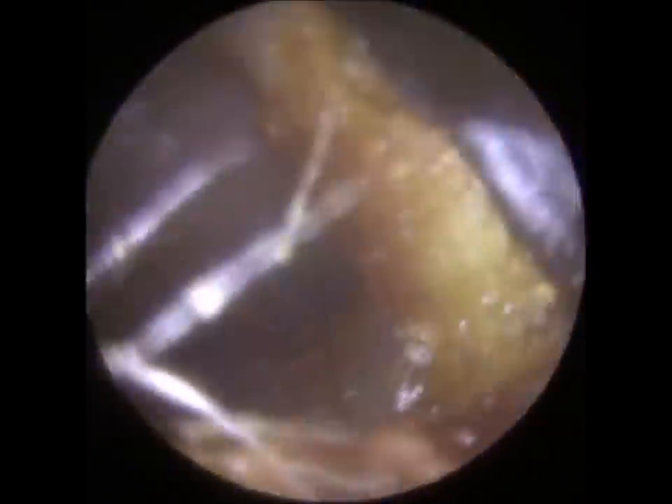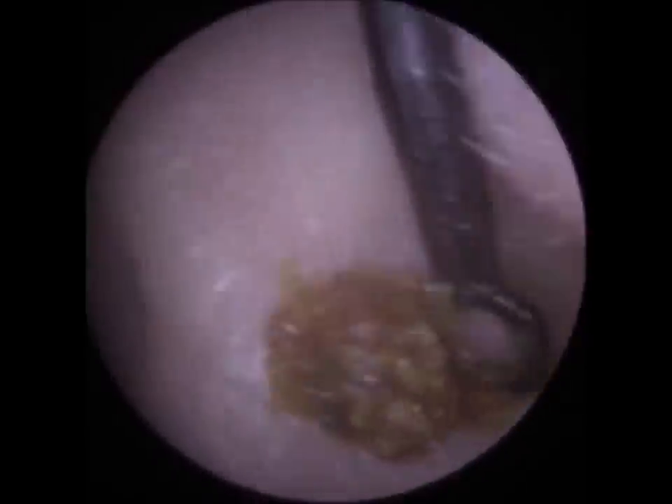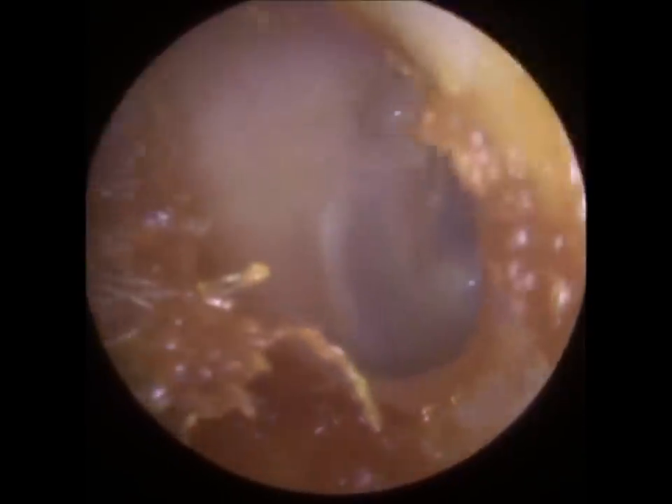If I fly next week it'll be, I won't hear for days I don't think. And if you go swimming, the water will get in behind the wax. I'm collecting a puddle so that won't help. But I've got all the wax that's blocking the ear canal clear. It's just waxed around the edge now.